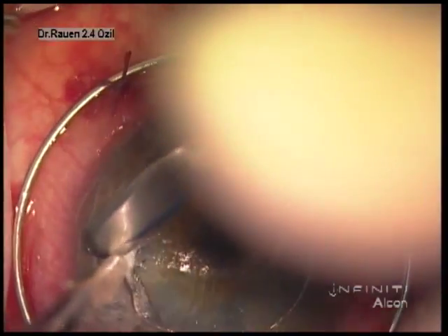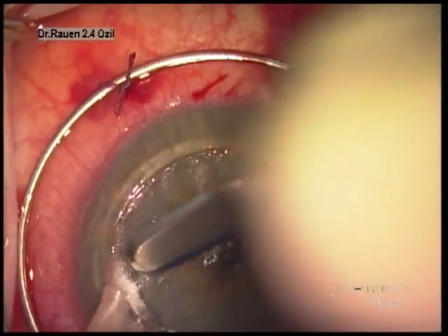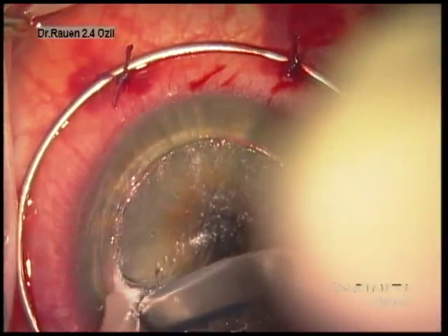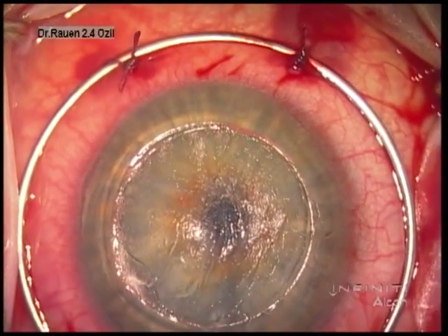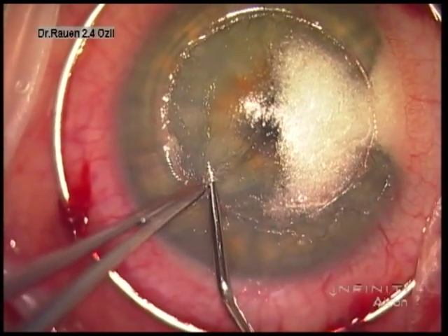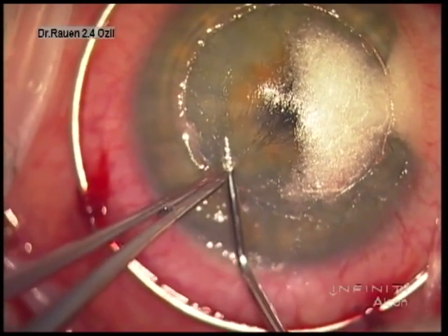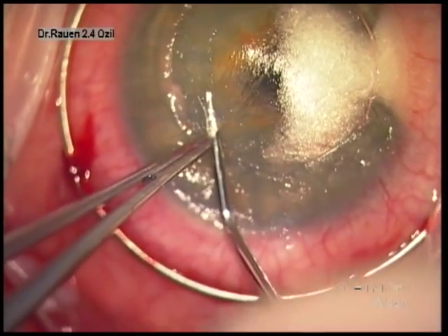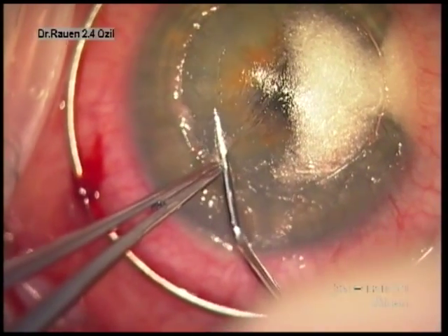We're probably left with a bed in this case of about 150 microns. We've also found it very useful to use the instrument set designed by Dr. Fogla, and you'll see the first of the instruments here. This dissector functions very much like a spike, and you can see with gentle wiggling of the instrument we can advance it into the remaining stroma.